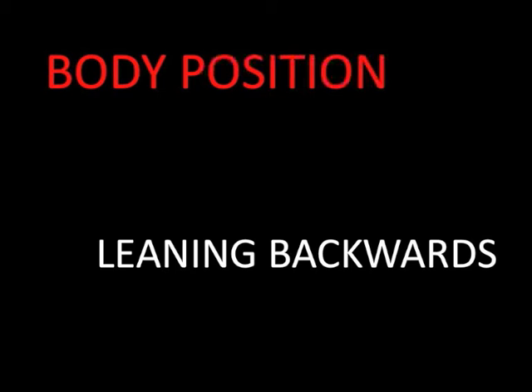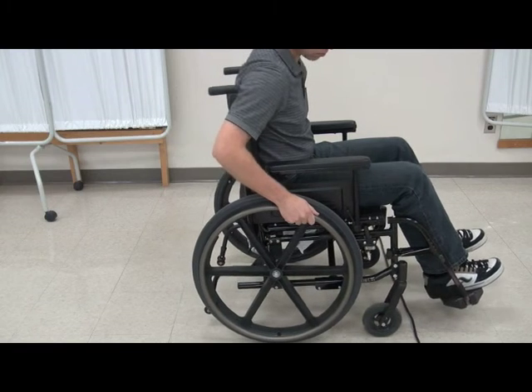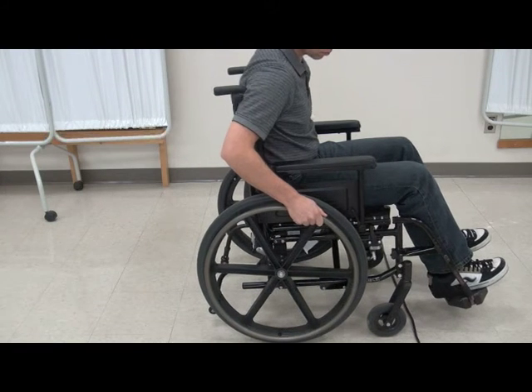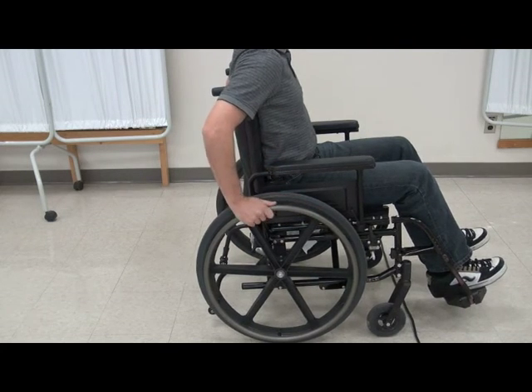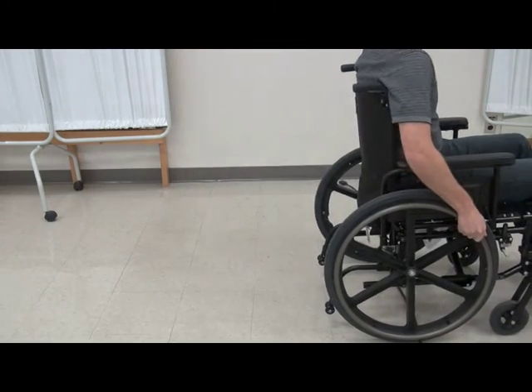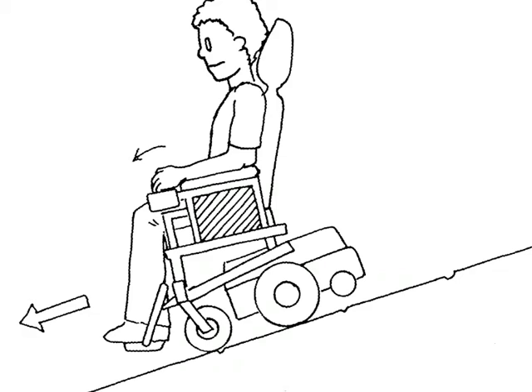There are some situations where leaning back in the wheelchair is helpful. Although we generally sit upright in the wheelchair, we often sit slightly forwards with our shoulders away from the backrest. By straightening your trunk and bringing your shoulders or even your head backwards, you can shift your weight further back in the wheelchair. This is helpful in situations where you want to get your casters over an obstacle or even briefly pop them off the ground. For example, propelling over an electrical cord or on carpet is easier if you take some weight off the casters.